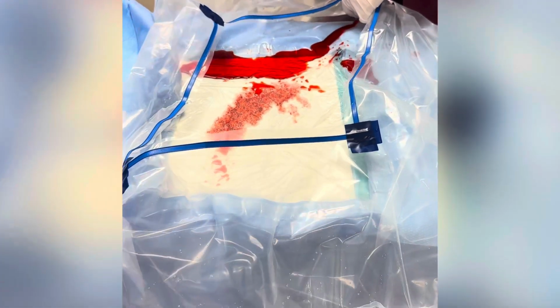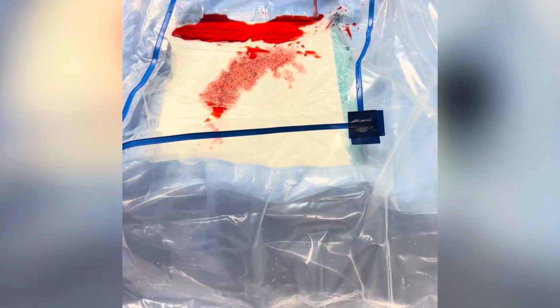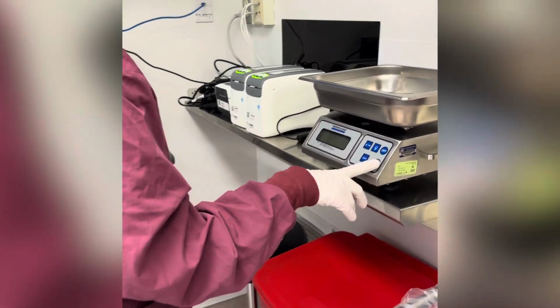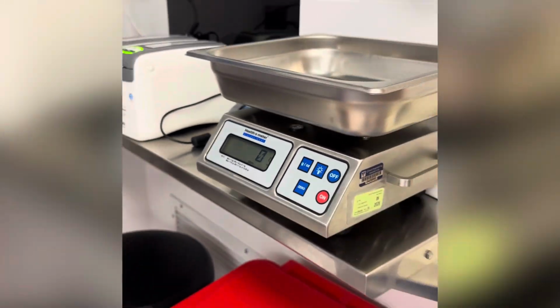Alright, placenta is delivered and the surgical tech is suctioning as much blood as possible. This may be a good time to weigh a set of laps. Turn the scale on and be sure it reads 0. If it's reading negative, either zero the scale until it reads 0 or turn it off and turn it back on. Here we're placing 10 laps with 1 lap bag.